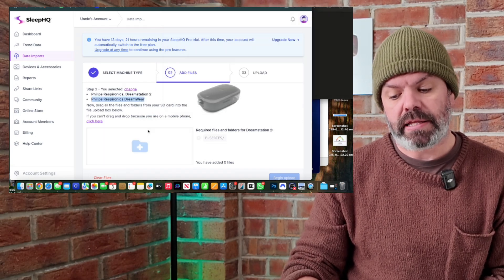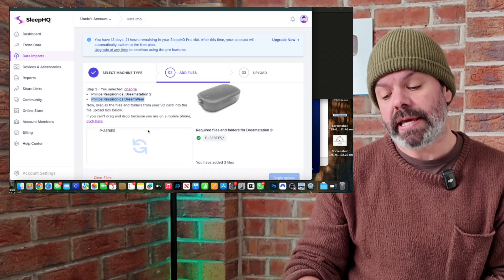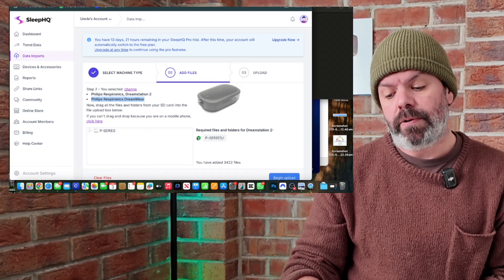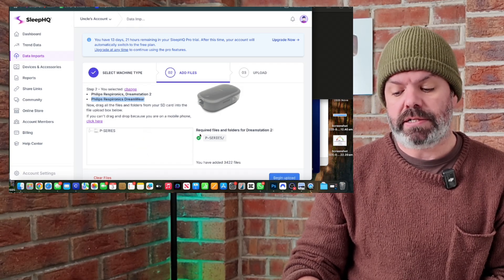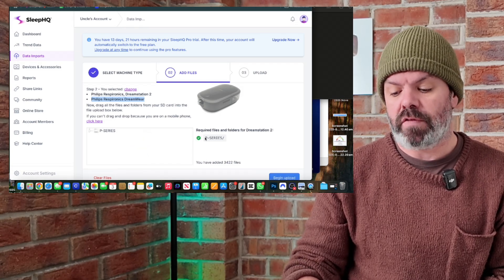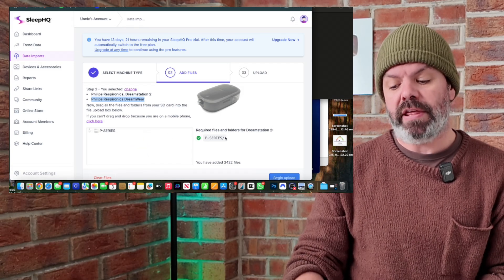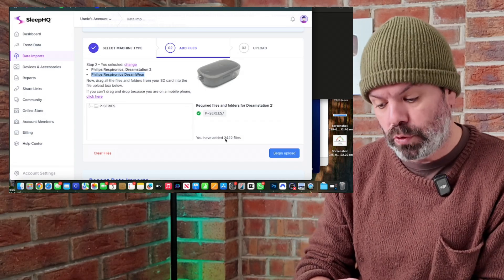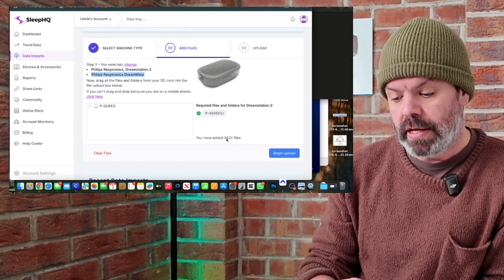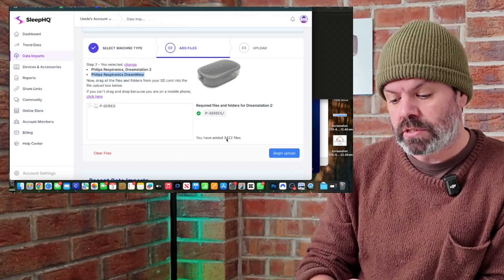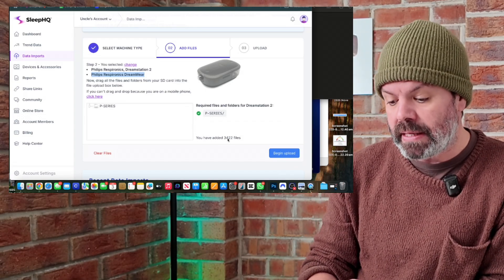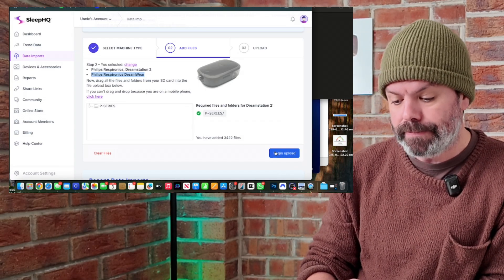And all I'm going to do now is drag and drop this P-Series folder into the box. You can see there's a little green tick here where it says P-Series and I've added 3,422 files. And now I'll just select begin upload.